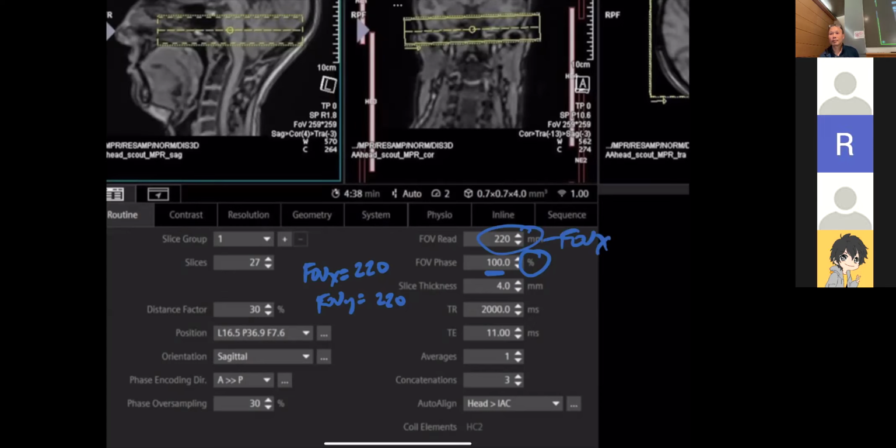Does this relate back to the curves we saw in the beginning of this? Yeah, so remember read is always going to be GX, and phase for this class is the GY. Okay, that's just the convention. And so anytime you read an MRI paper or something, that's just the thing. And also, just to keep things confusing enough, this is also equals frequency. All right, that's just by convention.